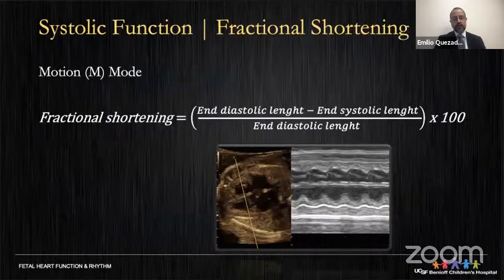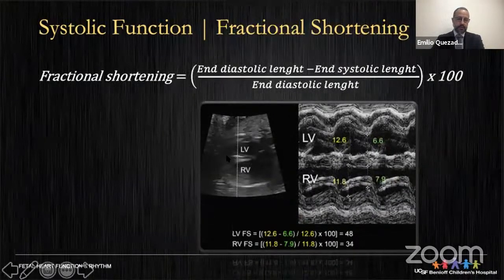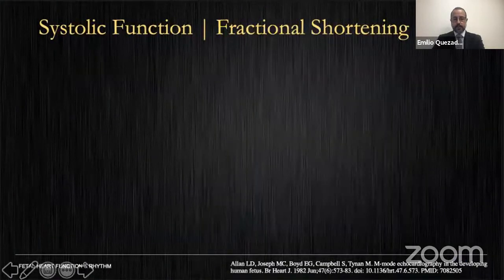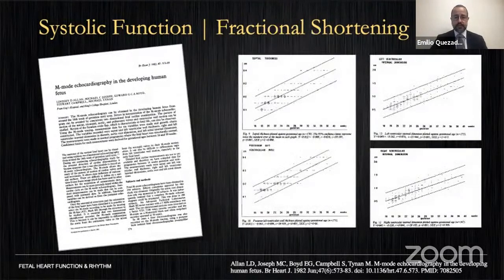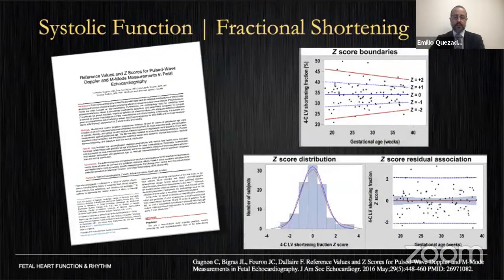Fractional shortening is obtained using motion or M-mode and calculated with a standard formula. The M-mode line must be perpendicular to the ventricular septum and always obtained in an adequate four-chamber view. Here we see measurement of fractional shortening in both the left and right ventricles. Normal values in human fetuses were determined almost three decades ago.